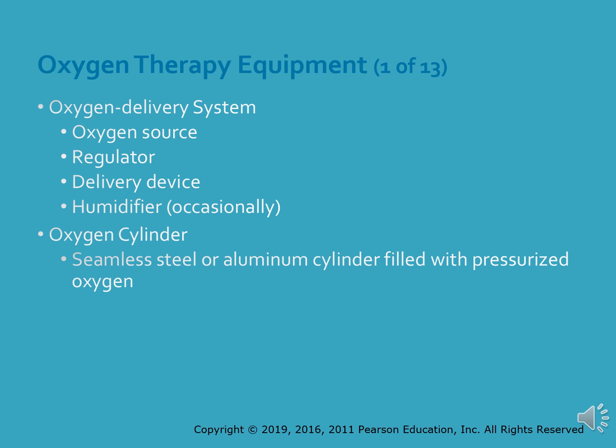Part of your duty as an emergency medical responder is to make certain that oxygen cylinders are full and ready to use before they are needed for patient care. The amount of oxygen in a cylinder is expressed in pounds per square inch, or psi, of pressure. In most cases, you will use a pressure gauge to determine the pressure remaining in the tank. The pressure gauge is located directly on the pressure regulator and will display the actual pressure inside the tank. A cylinder is considered full at 2,000 psi, half full at 1,000 psi, and a quarter full at 500 psi.